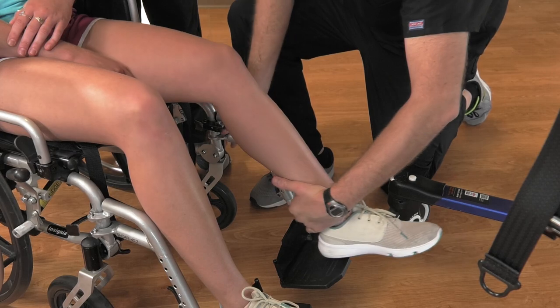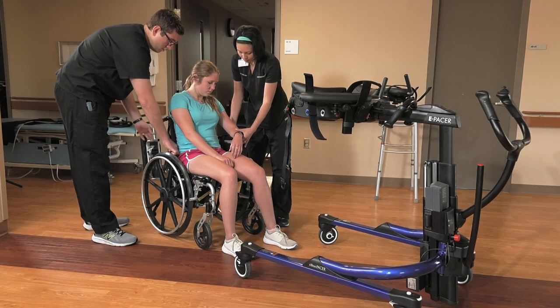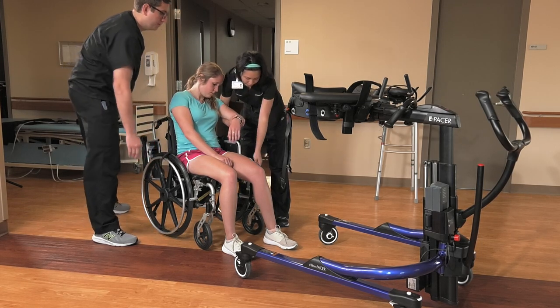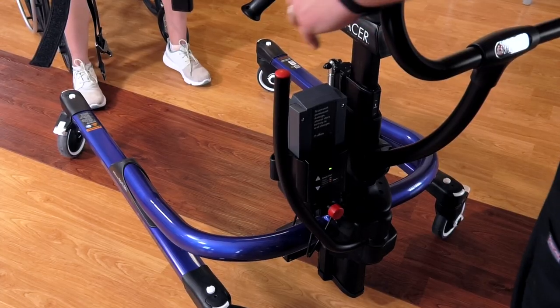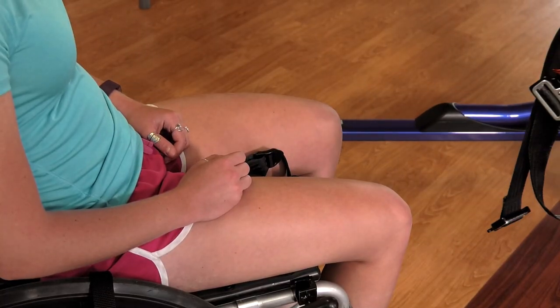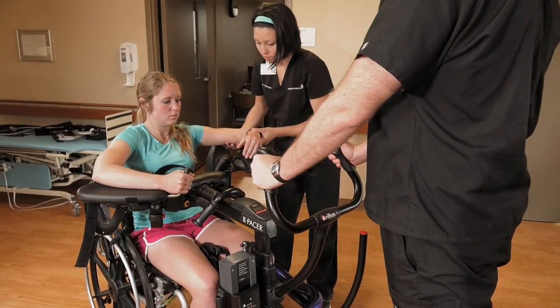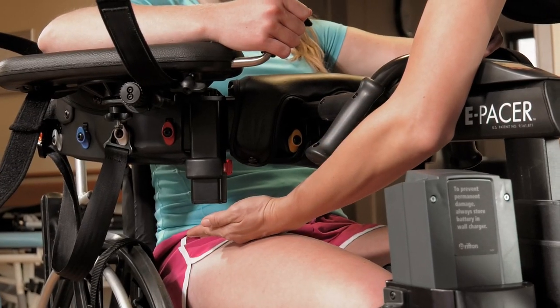Remove the wheelchair footrests and armrests. Have a second person ensure that the patient is secure. Spread the base so that it fits around the wheelchair wheels. Adjust the body support height until it is one to two inches above the patient's thighs.